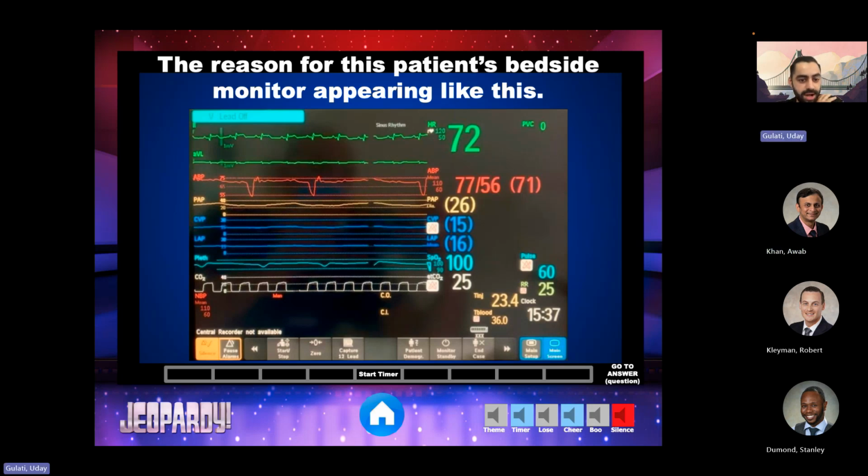So you've got the heart rate at the top, you've got the arterial line in the red, you've got a PA catheter in place. They're alive because their end tidal looks great. The arterial is the red line. Yeah. That's okay, really cool. I thought AB.